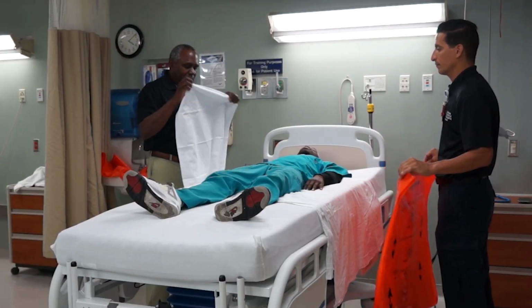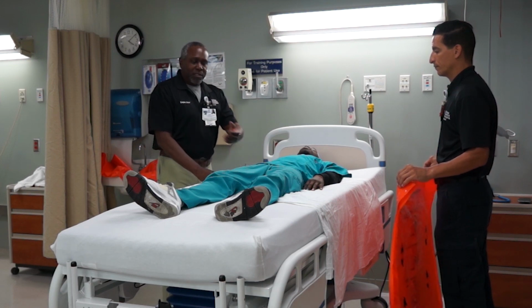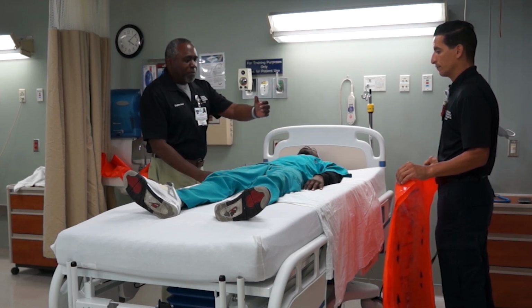I'm going to take a regular pillowcase to secure the patient's arm to his torso so that it doesn't wind up getting caught underneath the patient while we pronate him. And during the pronation, I'm going to also monitor the other arm to make sure it doesn't wind up underneath the patient's torso.